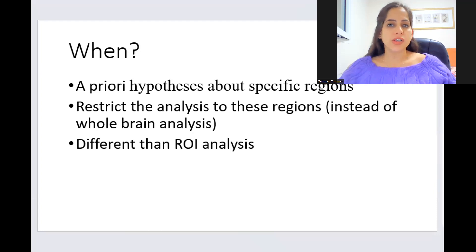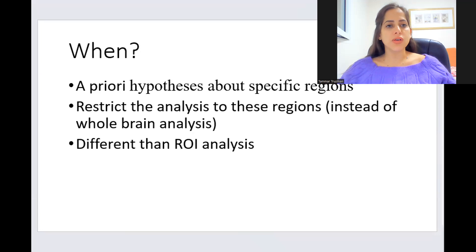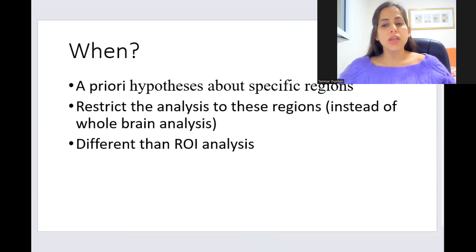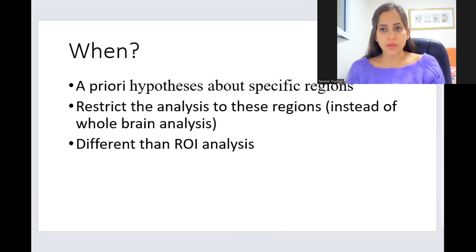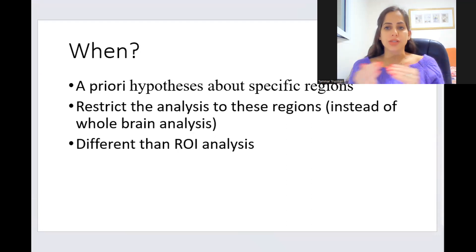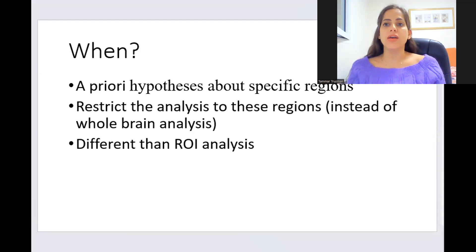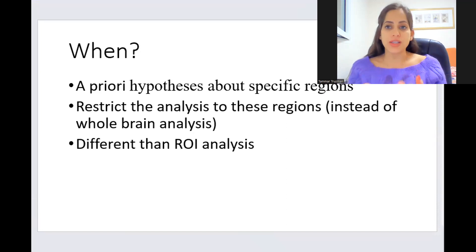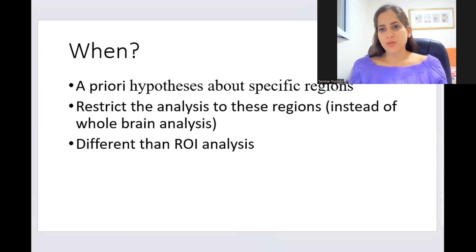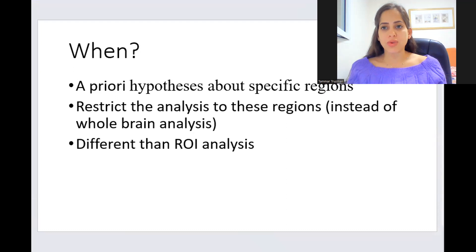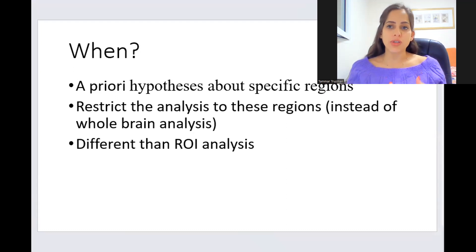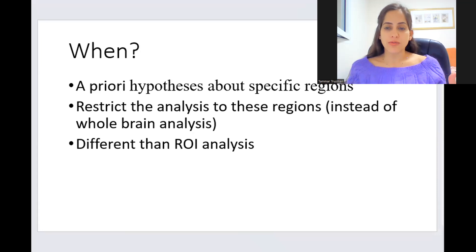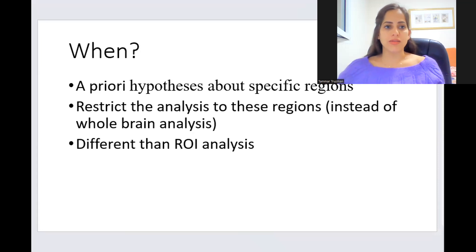But in small volume correction, we are not averaging. What we do is just using a more liberal threshold due to the fact that we restrict the analysis to a smaller volume, not to all the brain. So it means that the threshold we are using is more liberal and we are looking only at the voxels within this volume of interest that pass these thresholds.